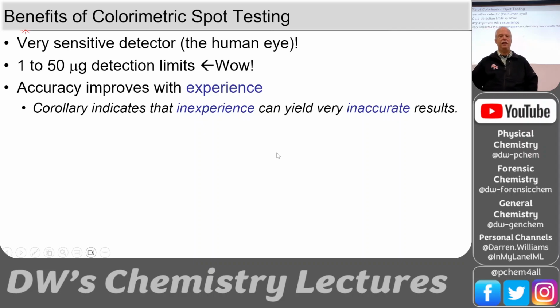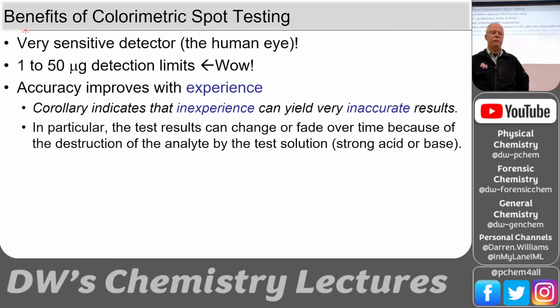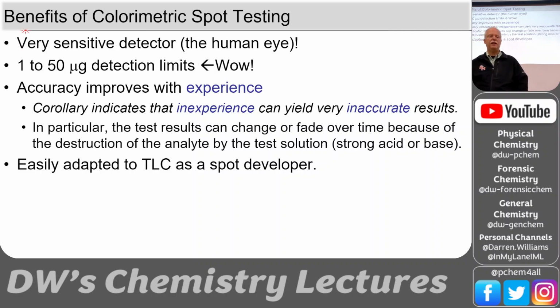Okay, inexperience can lead to inaccurate results, for sure. It can fade over time. And then this can also be easily adapted to TLC as a spot developer.